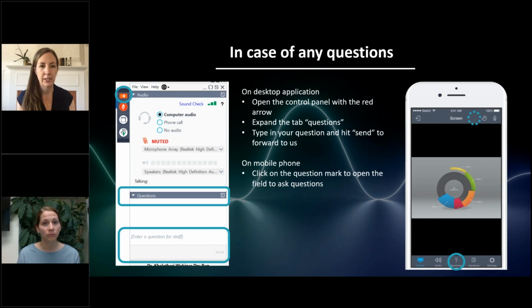I did do another project with Jason McAnany and Jason Park from UIC, and I'd be happy to share that reference, where we compared pattern ERG, a full field photopic negative response, and what we called the focal photopic negative response, which was a light stimulus that was in the same area as the pattern ERG. And it did look like capturing that peripheral retina was helpful in the IIH situation. So basically, they are complementary tests to each other that can be chosen here and there to get the information that you need.